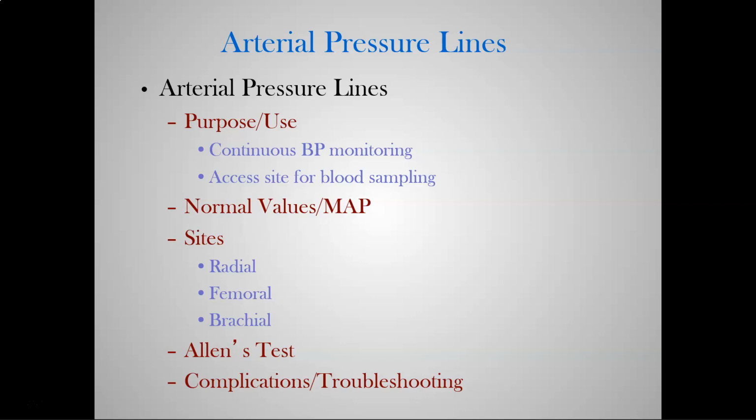Okay. Sometimes, and it's not super common, you will see what's called an axillary arterial line. An axillary arterial line is no different than any other arterial line, but it's in a funky place. It can be really challenging to keep in place, especially if you have a patient that's moving, is ambulatory. So just be aware it does exist. Those are your 3 most common sites: radial, femoral, brachial. If you see it on a test, I would definitely take axillary as well.